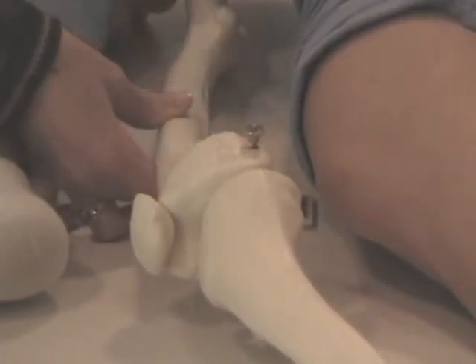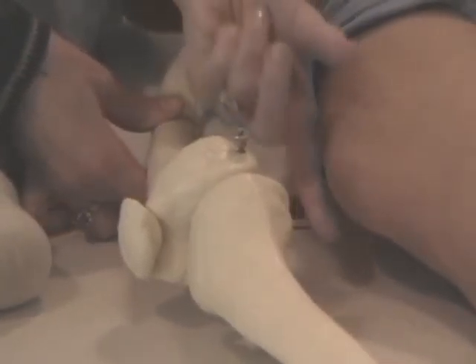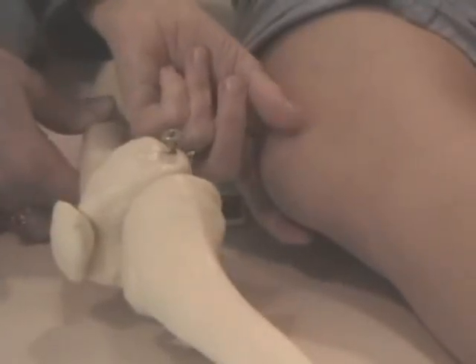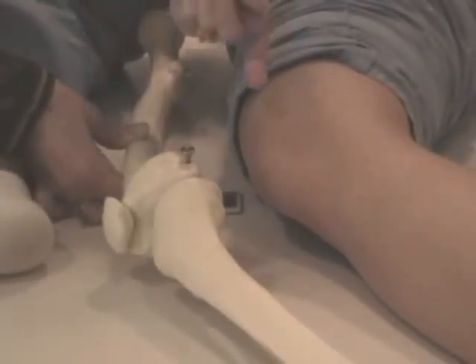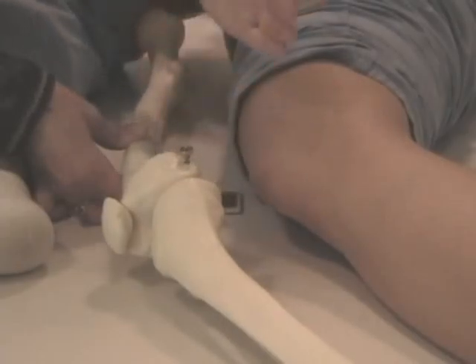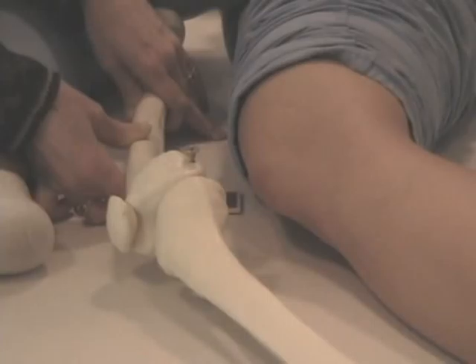But again, remember, we rolled the patient back and forth until we got the patella perpendicular. The two edges were one right on top of the other. If we did that well, the patella will be demonstrated away from the femoral condyles. But this can be tricky. You will tend to repeat lateral knees.